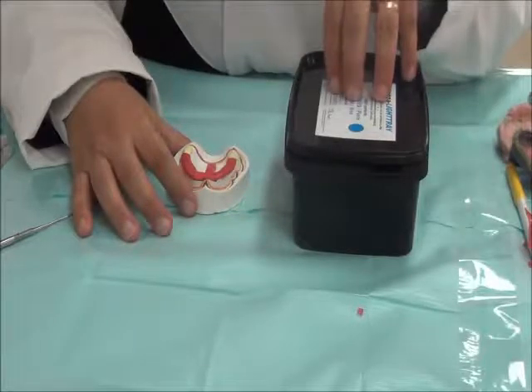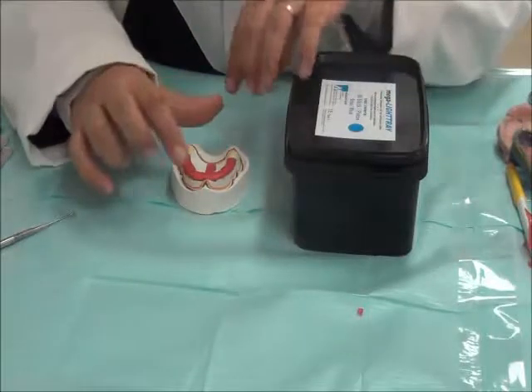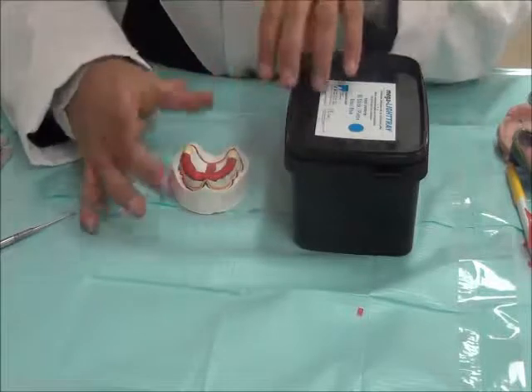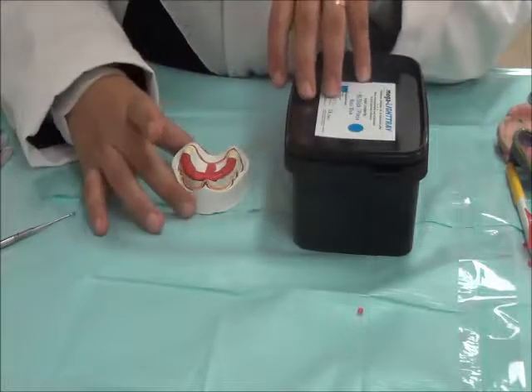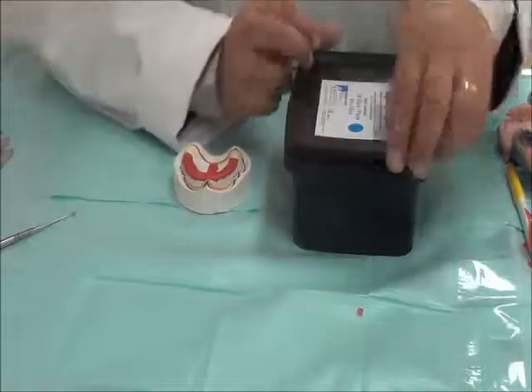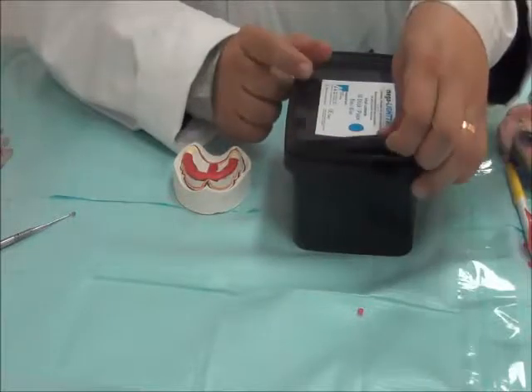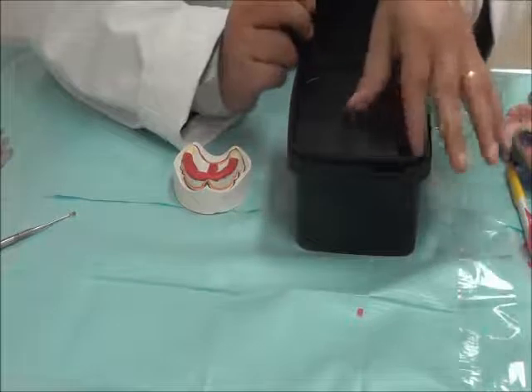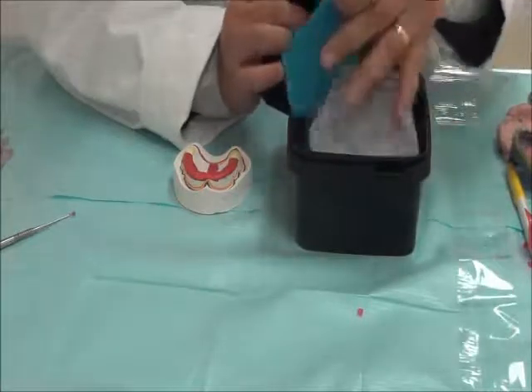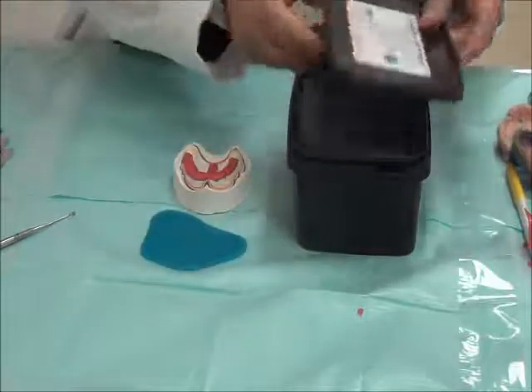For students' purposes, we use the light cure because it has an advantage that it's playable for a long time. You can work, you can modify, you can add and remove while still having time. And once you have finalized your shape, you can light cure it to become solid. So it has more working time. Light cure material comes in a light proof box, and this is also sealed with multiple sheets to protect it. So this is called light cure material.